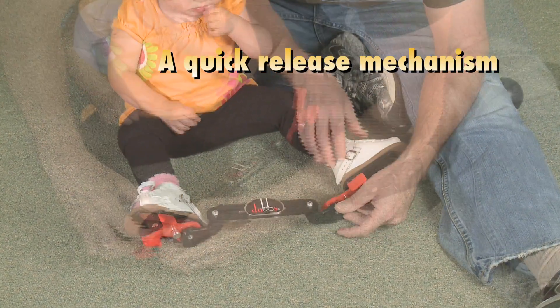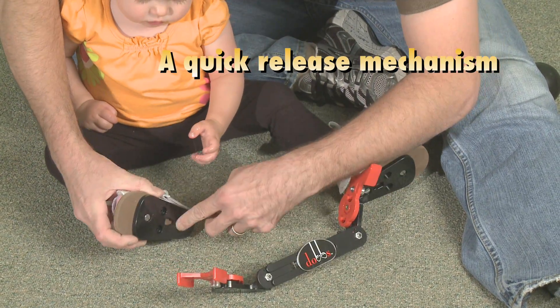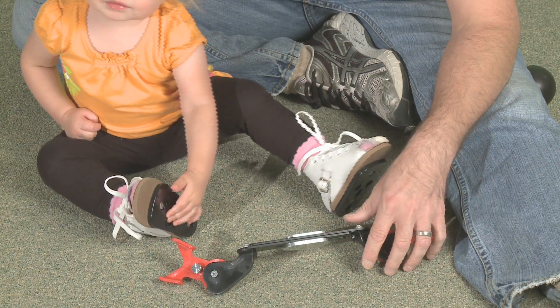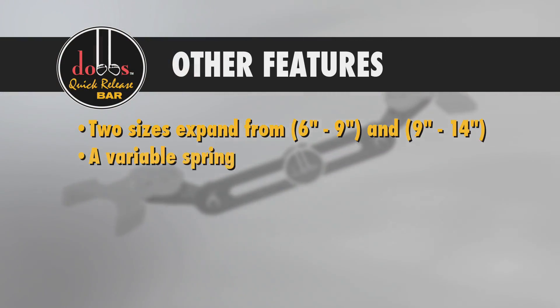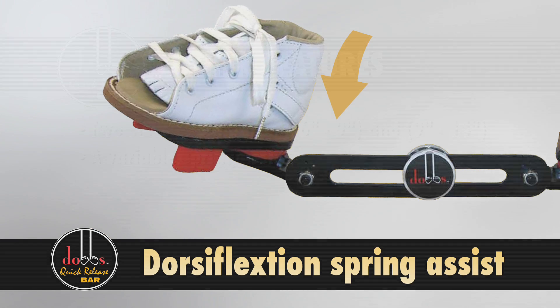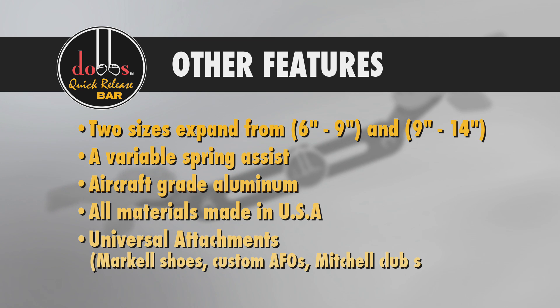The Dobbs Bar is also easy to use, with features that include a quick release that allows the shoes to snap on and off the brace for easy breastfeeding, diapering, car seats, and highchairs. Other features include expansion capabilities, spring assist, quality construction, and it accepts universal shoe attachments.